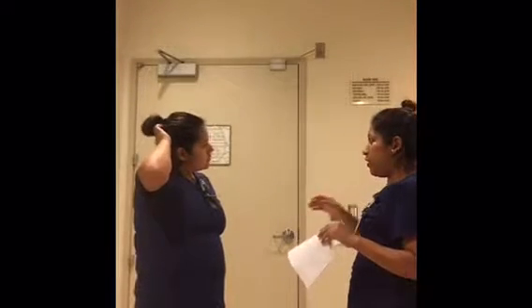And you don't need to take anything off, but I do need you to take anything off if you have earrings on, if you have a hearing aid, any dentures, any bobby pins, clips, or any facial jewelry. If there's a little metal thing in your scrunchie, I would need you to take that off for me before we begin, okay? Okay. Okay, perfect.